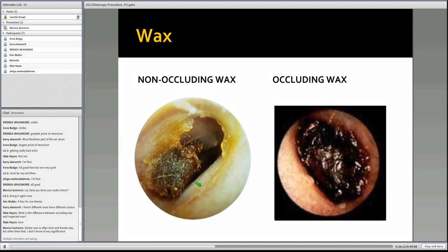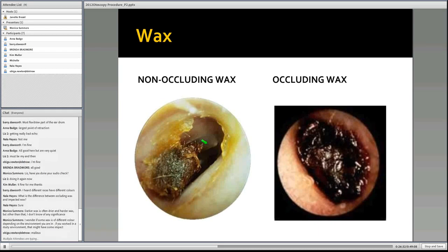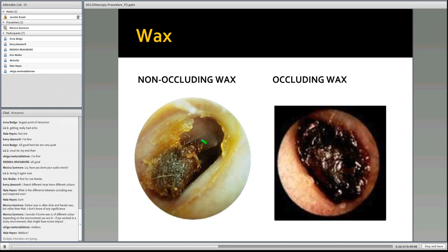You can see here I can see just past the wax, so it's not occluding. And I can actually see one of the landmarks. Can anyone tell me what landmark I'm seeing in the background there? The malleus, perfect. That's great, Abega. That's exactly what we're seeing.